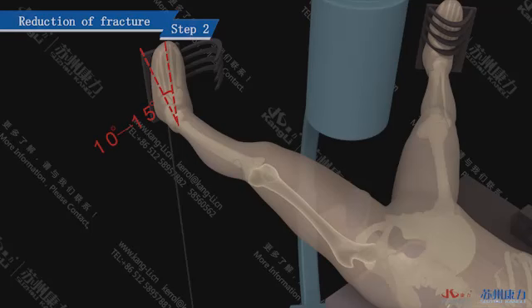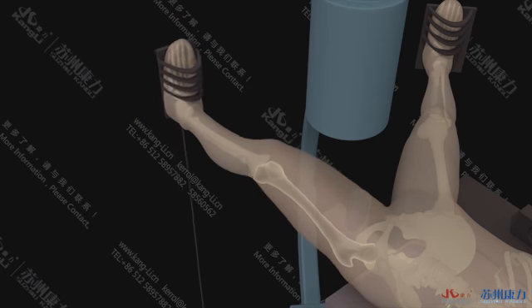Step 2: Reduction of Fracture. Perform reduction of the fracture and, when satisfied, rotate the injured limb internally by 10–15 degrees or more, then adduct by 10–15 degrees. Finally, fix on the traction bed.